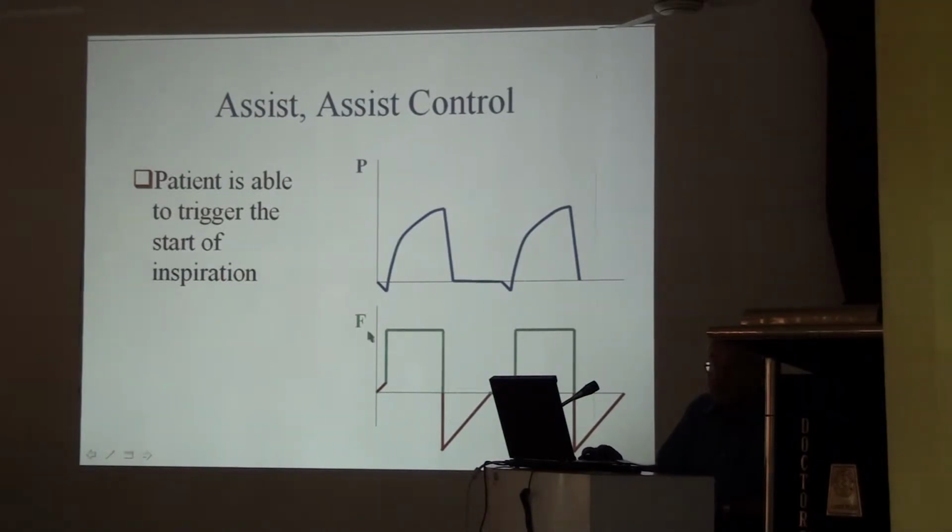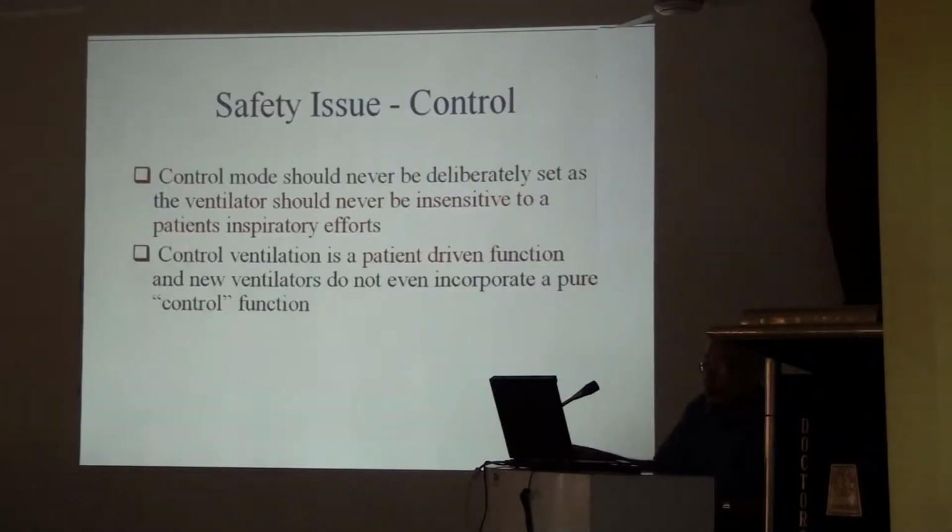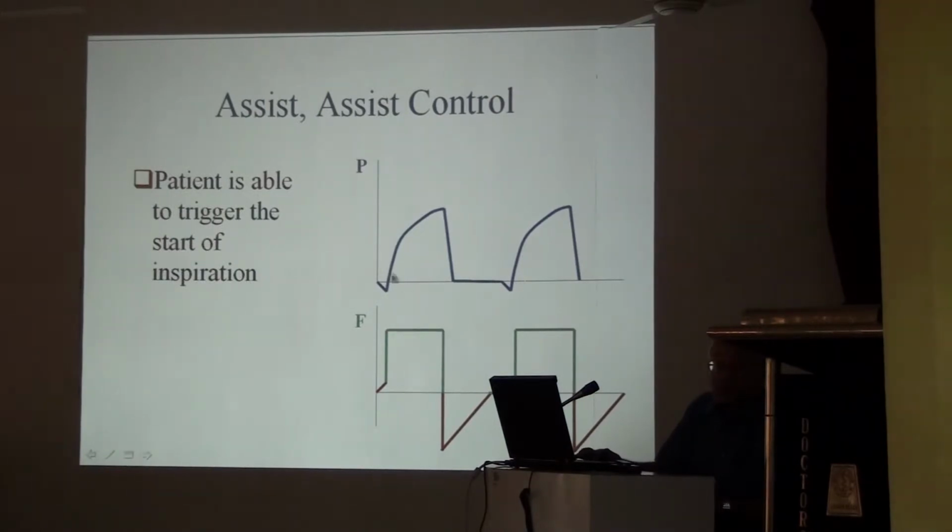So what is the difference between the earlier one and this one? There is no notch, no velocity. It is absolutely machine dependent. Here, the patient effort has been identified by the machine, and the machine starts with the patient's own inspiration. As we already learned, it may be pressure triggered or flow triggered, whatever the trigger mechanism, basically assist control works like this.